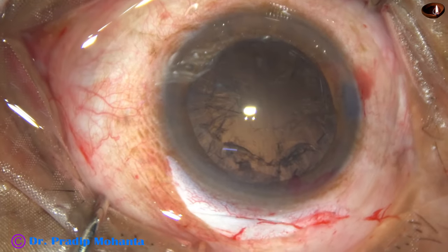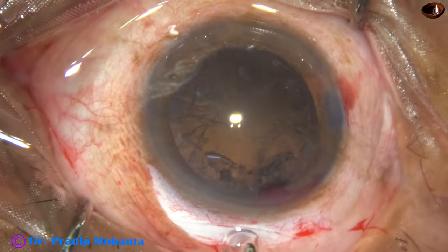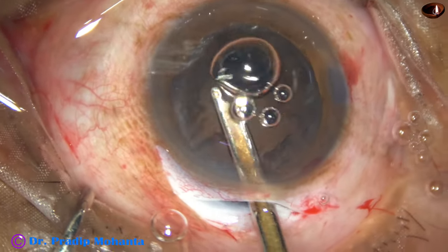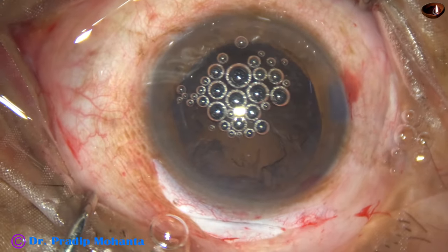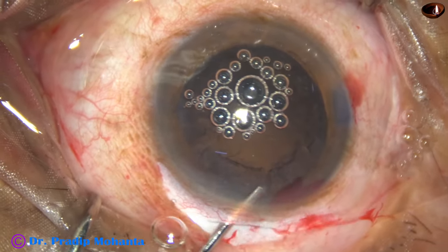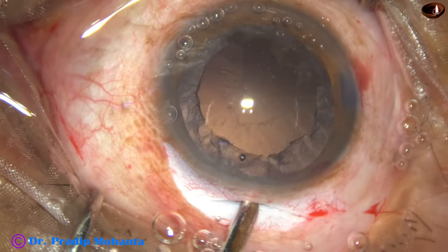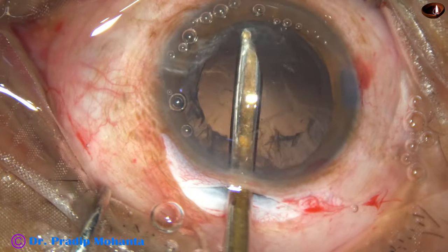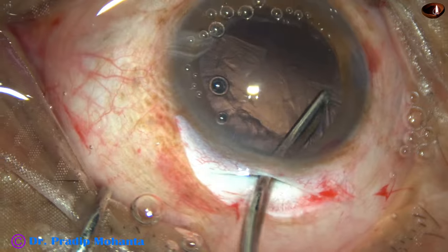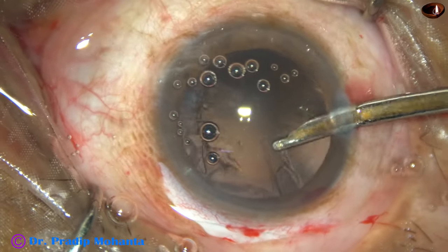And now there is a lot of cortex — we have to remove the cortex. This is a 23-gauge Simcoe cannula. I am flushing out some fluid through the aspirating port so that whatever cortex sticks to the undersurface of the cornea gets dislodged and we can have a clear view of the cortex. Now I am removing this cortex with visco inside the capsular bag. The idea is to remove the cortex from the sub-side port and adjacent area, and then I go through the side port and remove the rest of the cortex.